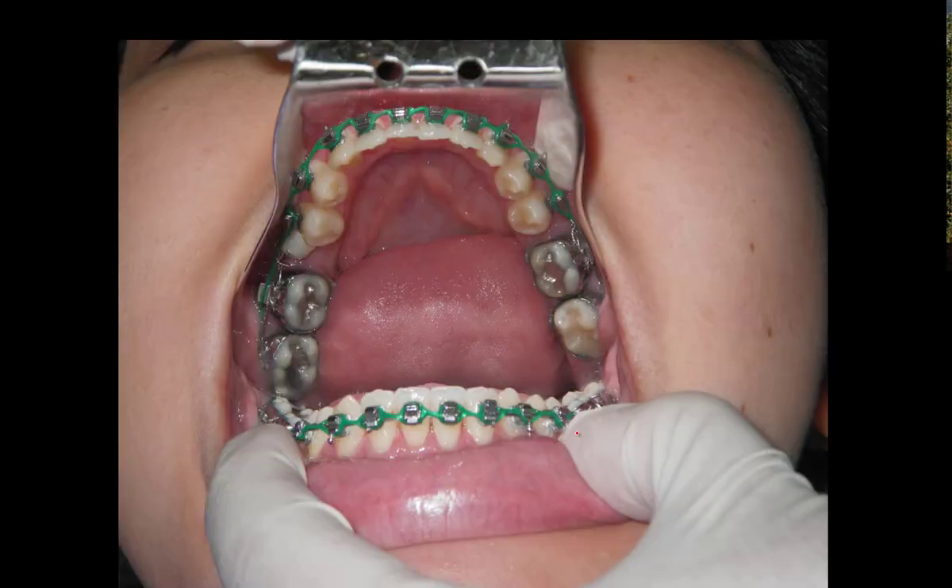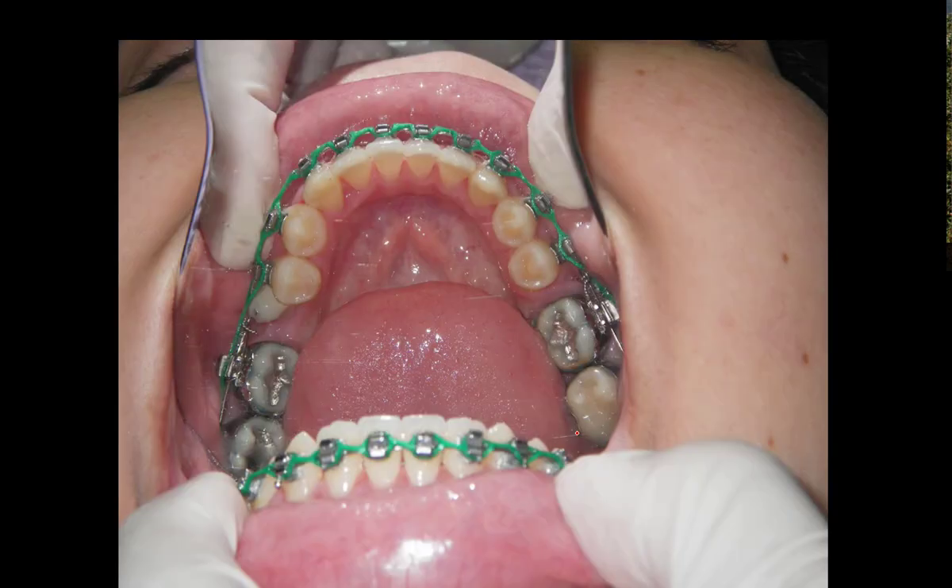I think that's after that screw is taken out. Here's a good shot of it where the screw is down in the cortical bone. We'll pull this tooth too, so this molar comes in contact with that. Then we'll have to take the screw out and finish with the Class II elastics — so this will be pulled back a little bit, but not much, so you won't notice it. Over here this is coming together, and you can observe the curvature — it's different over here than it is on this side. When we get through, it'll look pretty much the same.